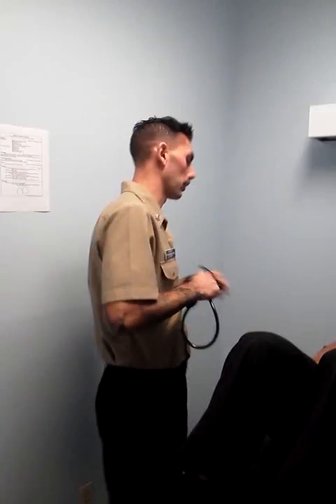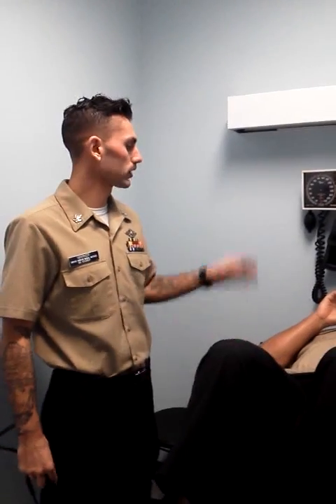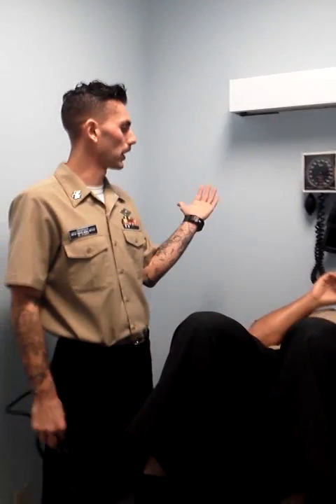After that, you're going to go ahead and position the patient. Cruise is already in the position that you need to be. Legs relaxed, he's supine, and then the head should be elevated a little bit. These tables are kind of already set up for that.